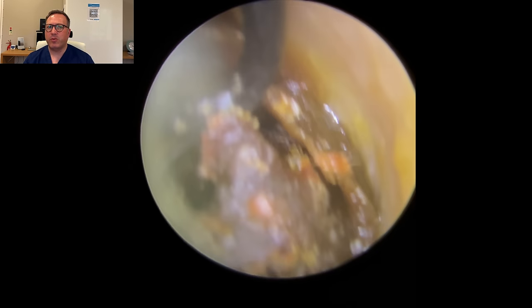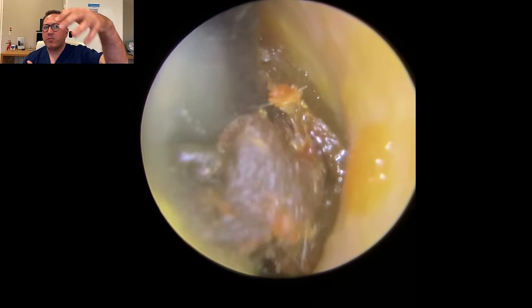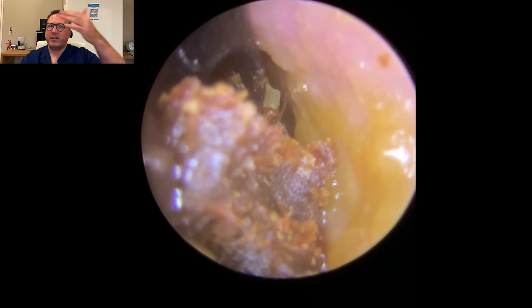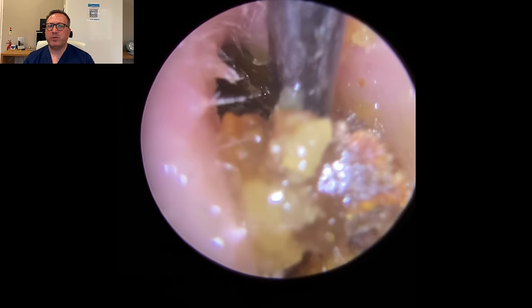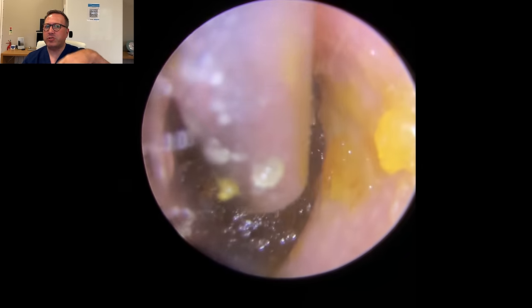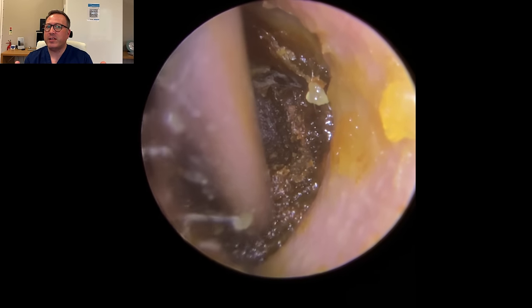So the Jobson horn's going to go in now. The Jobson horn is this curved spoon you can see here, which we use to pull down bigger pieces and harder pieces of wax. As we brought it down, we've actually flicked the front end of the wax over. And as we push down into it, you can see a much wetter type of wax squeeze out from the sides there. That's where the olive oil the patient's been putting has worked down the side and softened all the underlying wax.